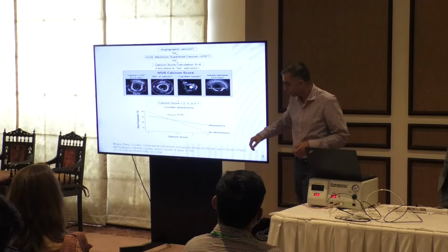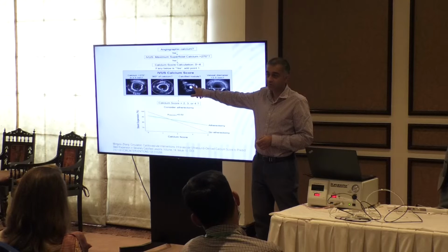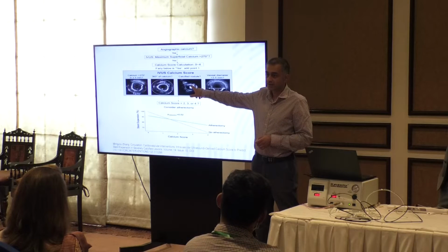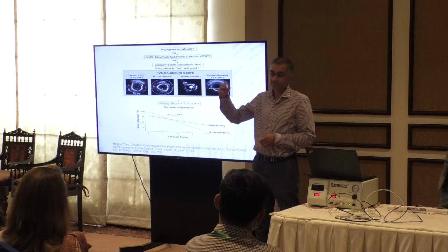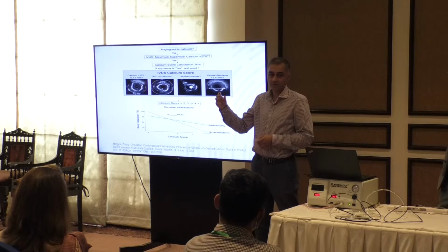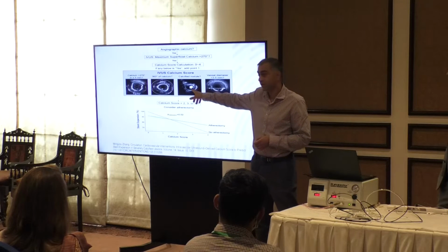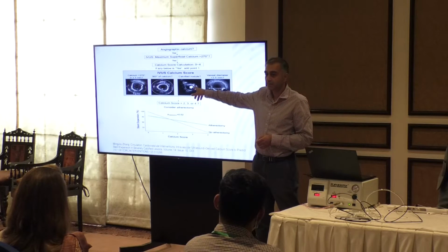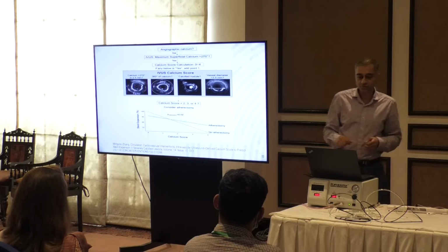And the other thing that's important, and I think we saw some of these on the live cases yesterday, is this thing called a calcium nodule. Calcium nodules are very, very difficult to deal with because there's no guarantee when you're burring that you're actually going to be burring the calcium nodule. There are a few little tricks that you can try to angulate the burr towards where you think the calcium nodule is. But on the whole, calcium nodules are very difficult to deal with. Okay, so that will allow you to give a score out of 4.